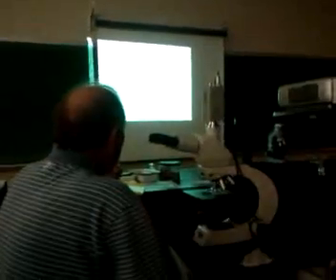Okay, now here's a question. I mean, that doesn't look like much of anything. It's just like, what I call, blah blah. What that is, though, these things right here, they are alveoli.